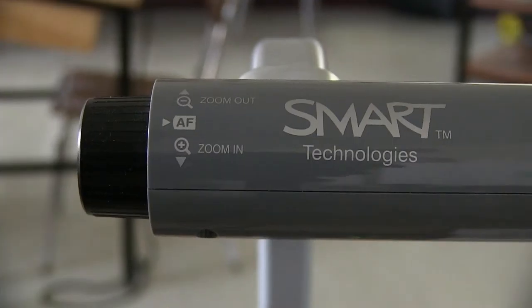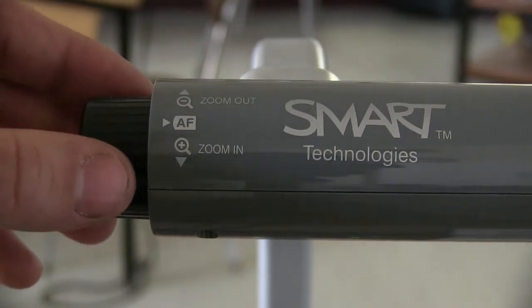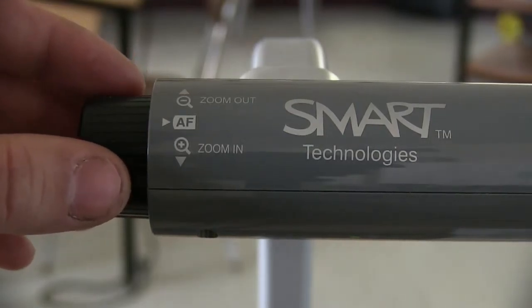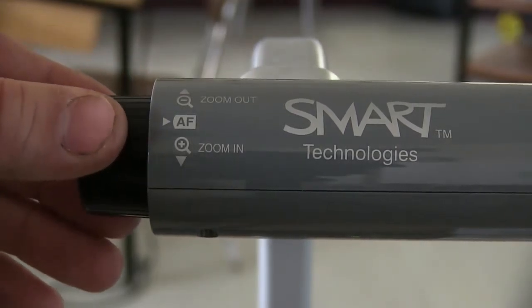To zoom in and out on the camera to enlarge a document or an object for the student, you simply turn this black knob down to zoom in and up to zoom out.